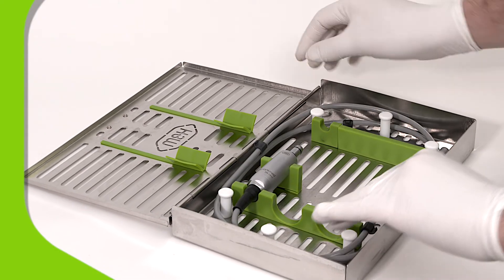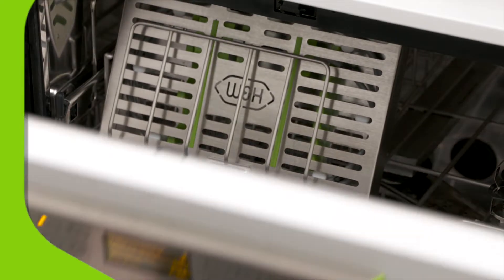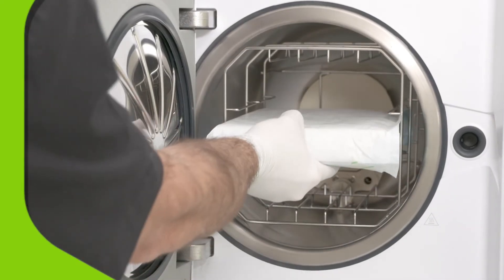And reprocessing couldn't be simpler. All handpieces and cables should be disinfected in a thermowasher and then vacuum sterilized to meet the highest standards of safety.